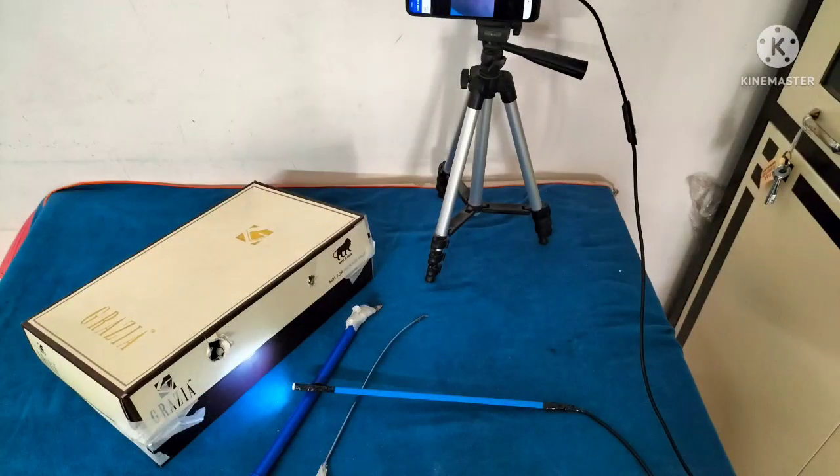This is how the setup looks. The mobile connected to the camera is mounted on the tripod stand and it acts as a screen. Once the setup has been made, we'll perform the inspection part. For this we'll introduce the camera through one of the ports. Once inside the box, we'll rotate the camera along its axis to maintain the horizon. Inside the box we'll inspect it, and the geometrical figures and numbers we have written should be visible.